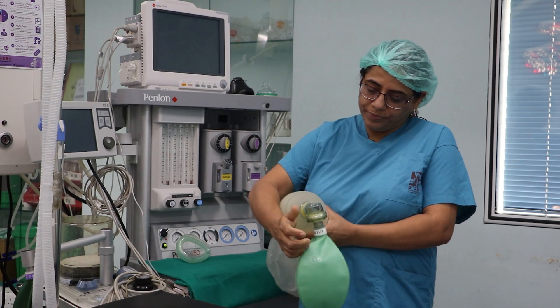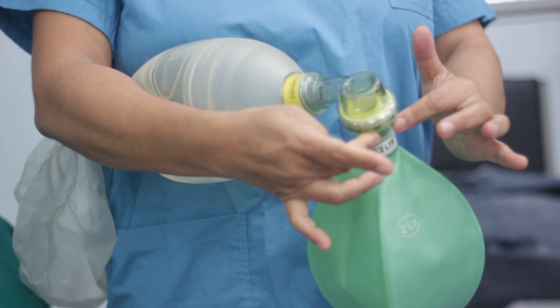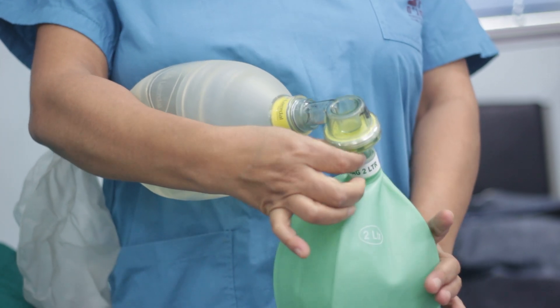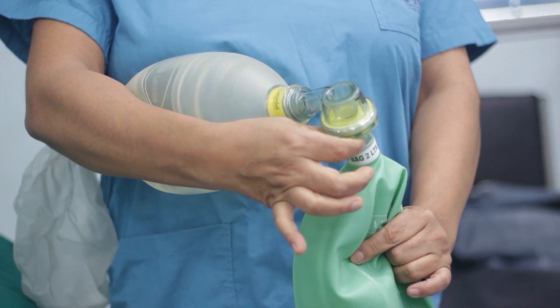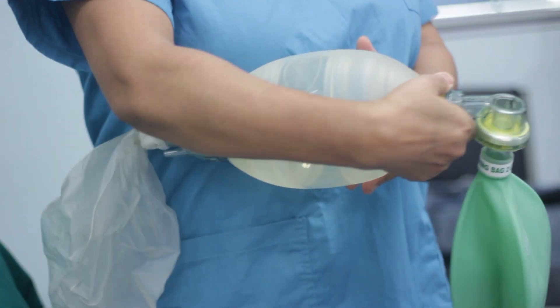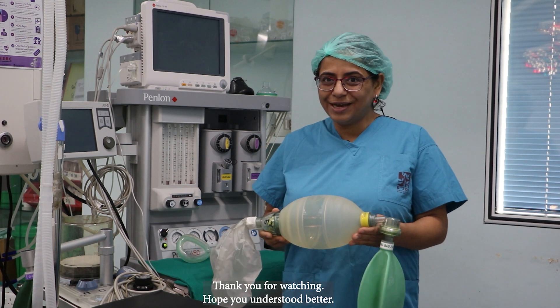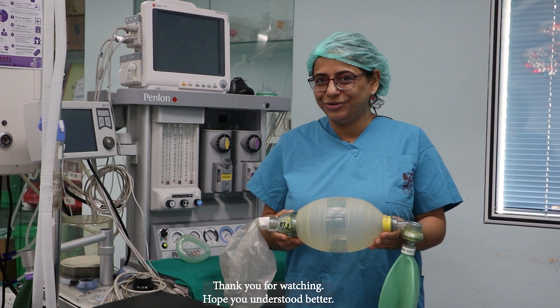Now when I squeeze it back, I have to feel the air coming out to the atmosphere. So when I squeeze it, the air is coming out to the atmosphere — I can feel it in my hand. This is how we check the integrity of this device before using it on a patient.